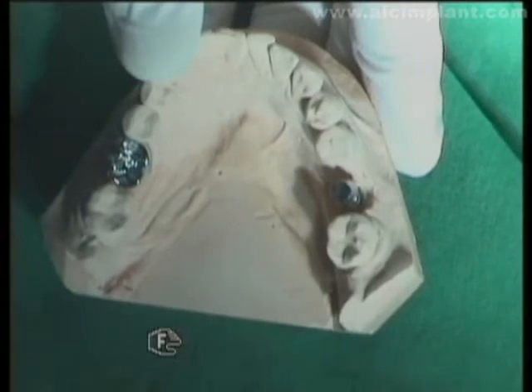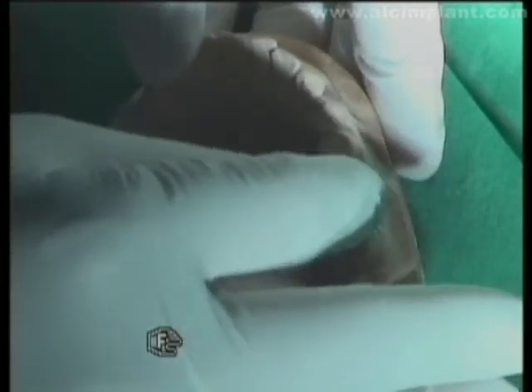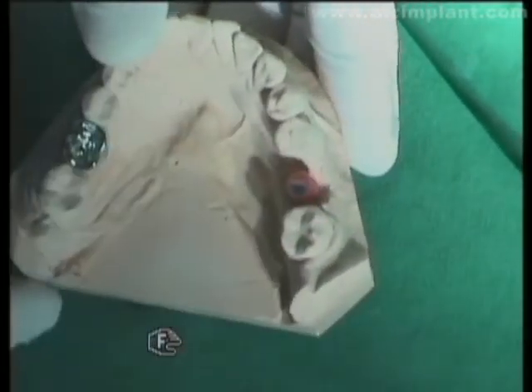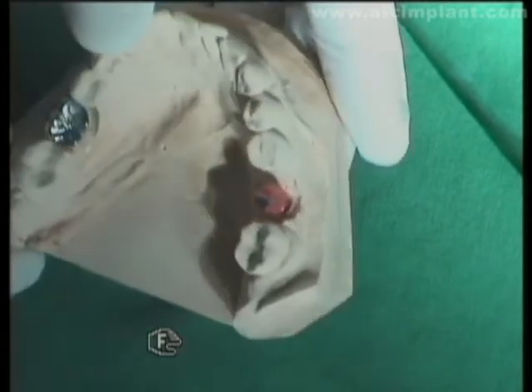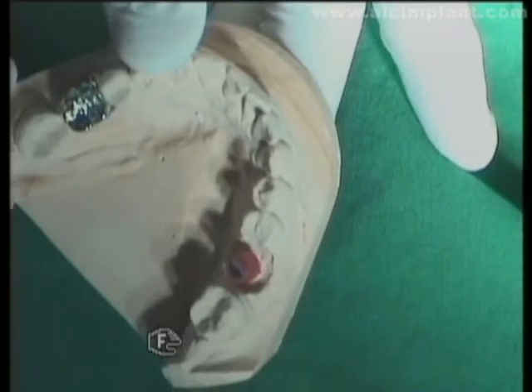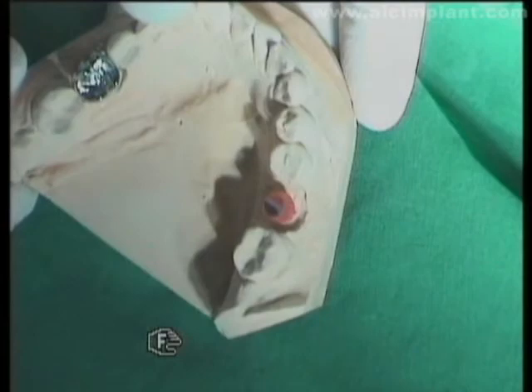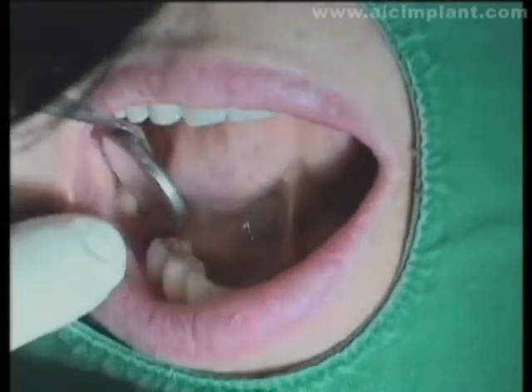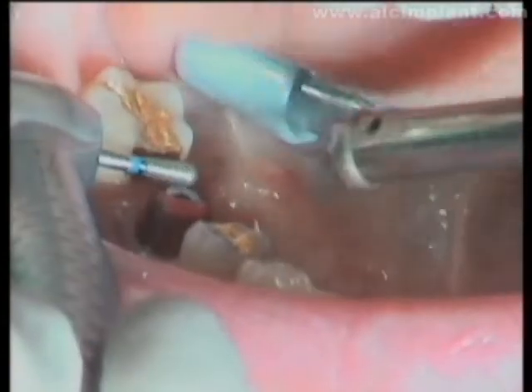This is the final prosthesis made through wax-up procedures. If you take a close look, the analog has been modified slightly. A 4 millimeter abutment was connected, but the vertical space was slightly insufficient for crown fabrication. After reducing the insufficient area, a reduction cap that will facilitate the reduction process intraorally was made. After connecting the cap, the convex redundant area was removed using a burr. This is how to do modifications using a reduction cap.